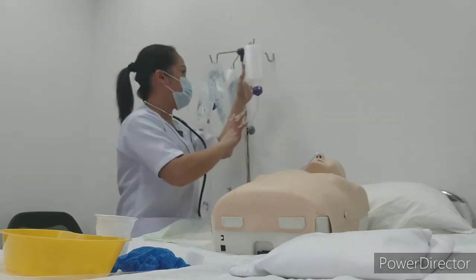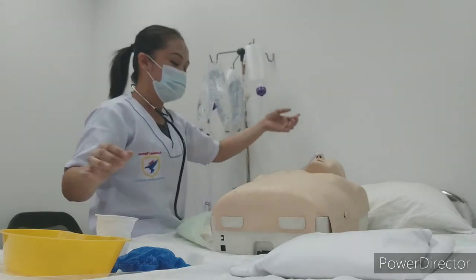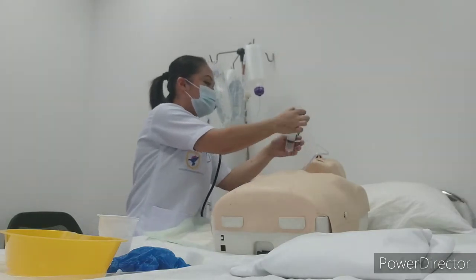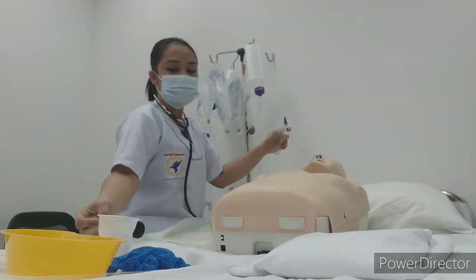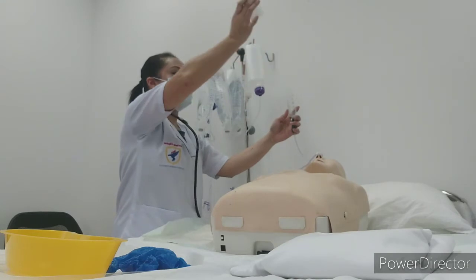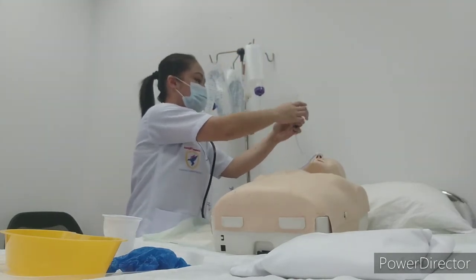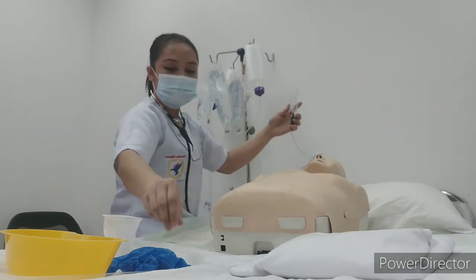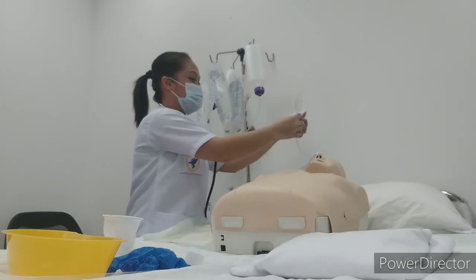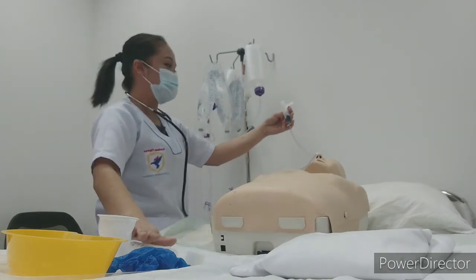And then before we feed this one, we need to do water flushing also. So we will again pinch, open, and then connect. Then 30 ml of water again. So it's okay now. We flushed the water already. So again we will take the gauze, so that it will prevent the leaking. Okay, set aside this one, put in the proper place.